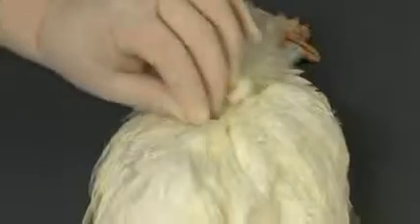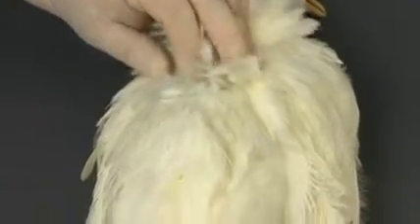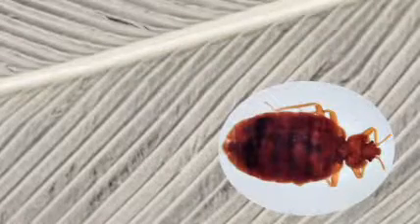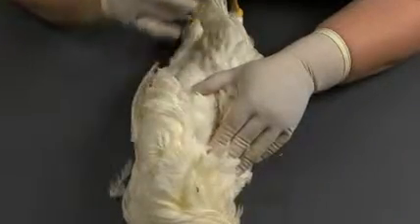removed. Move the feathers aside and examine the skin across the entire body surface. The skin is normally very thin, and the amount of pigment varies from pink to black. The skin should be free of exudate and have little or no scale. Look for any lesions or evidence of ectoparasites. Some species of parasite inhabit the surface of the skin, while others are more likely to be found on the feather barbules. If parasites are present, they can be collected and submitted for identification.